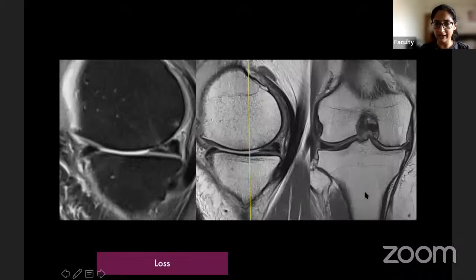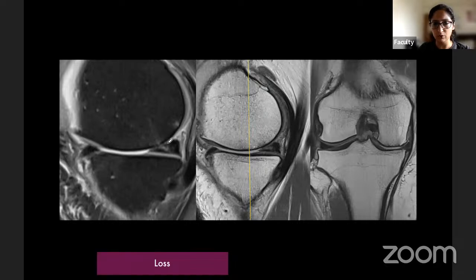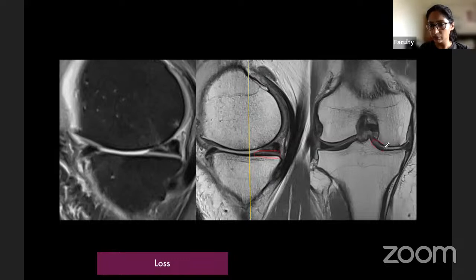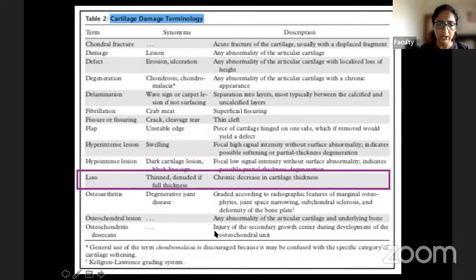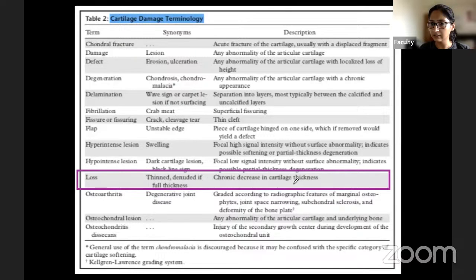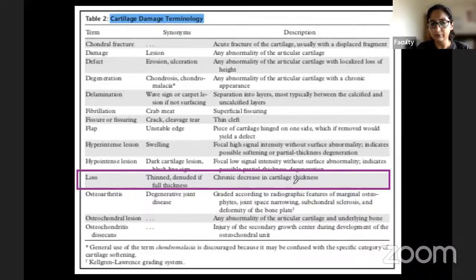Chondral loss: diffuse absence of articular cartilage. In this example, the posterior medial tibial and inner one-third cartilage are relatively preserved, but the rest is completely gone. Chondral loss is described as thin, denuded if full thickness, representing a chronic degenerative process occurring over time.